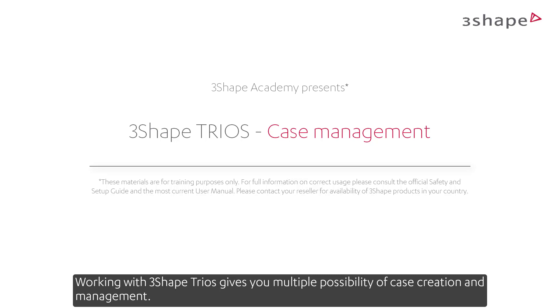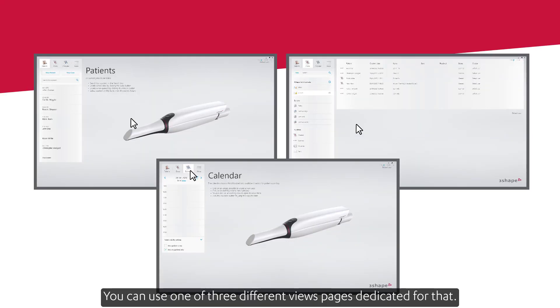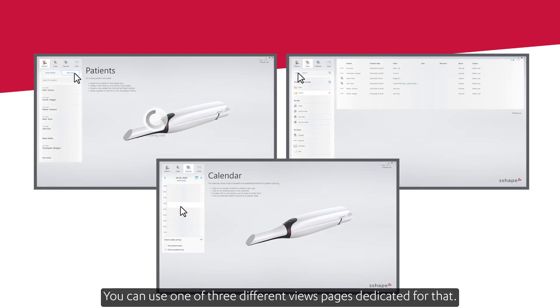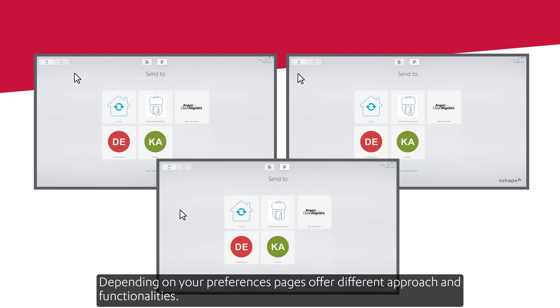Working with 3Shape Trios gives you multiple possibilities of case creation and management. You can use one of three different view pages dedicated for this. Depending on your preferences, pages offer different approaches and functionalities.